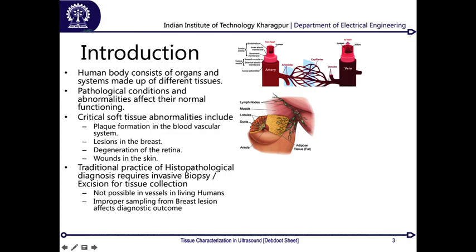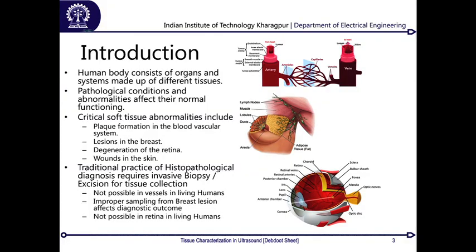Similarly for breast, although breast biopsy is quite common, it is a very painful process, and if we can find some way of getting rid of it, that would obviously be much more appreciable. You can definitely not do it on the retina, because the moment you probe the retina by this invasive method, you are going to damage it. Either way, whether or not you investigate, it would naturally get damaged after a few years. So it's not technically feasible.